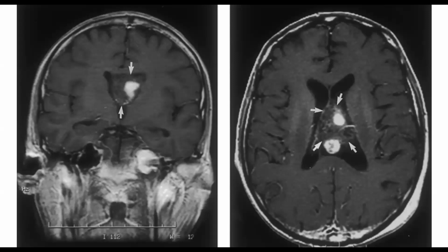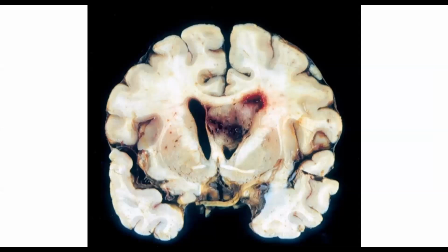Look at that, look at this imaging. Isn't that cool? You see on the left, the tumor is filling the left ventricle. Most of it is iso-intense to weakly contrast enhancing. Look at these two foci. They were also hemorrhagic. All right, hemorrhagic foci, and here is the autopsy specimen. All right, photograph. This is from the paper. And again, you can see in the left ventricle, you have this homogeneous tan mass with these two hemorrhagic foci here and here. Okay. All right.